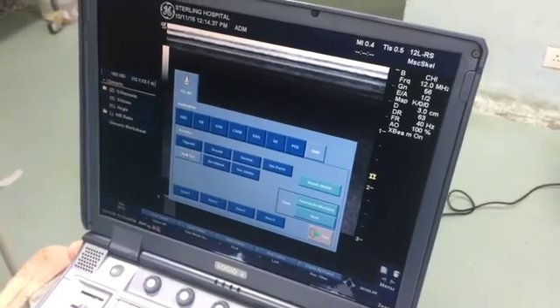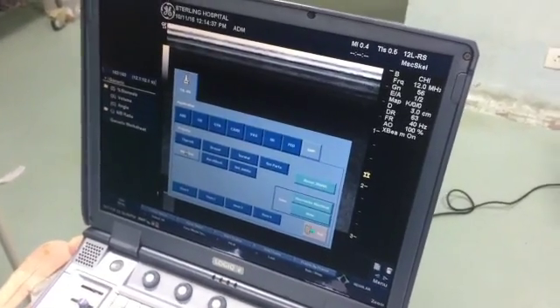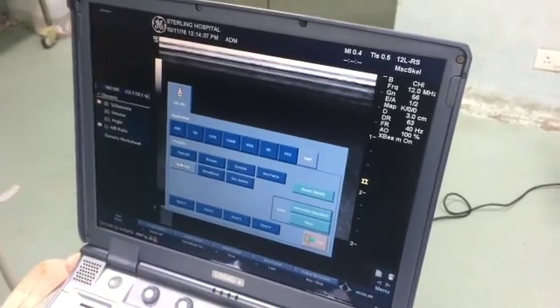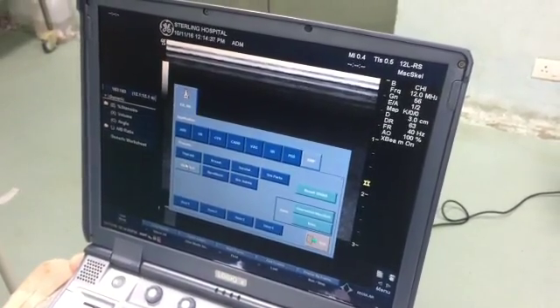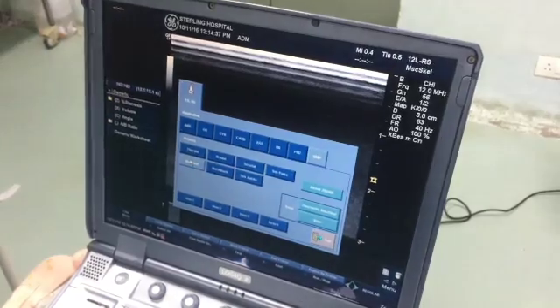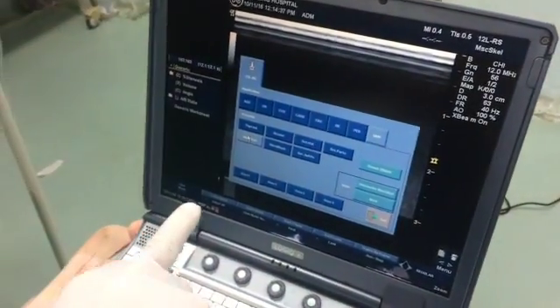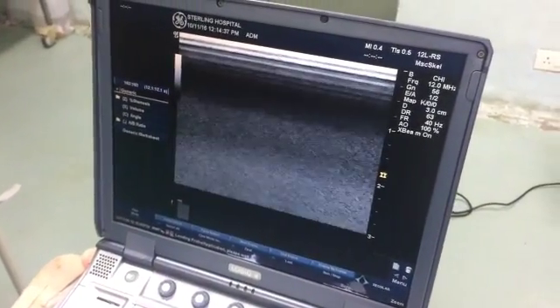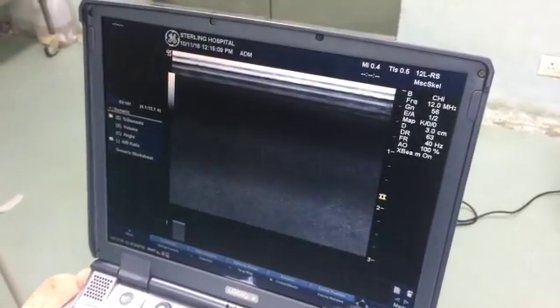If you look at the ultrasound machine, you have to set the preset first. You have to select musculoskeletal for better visualization of the muscle and the plane between internal oblique and transverse abdominis — that is the TAP plane. The second step is to set the depth of the machine, roughly 3 to 4 cm. If the patient is obese, you require more, but you have to select the depth according to the patient.